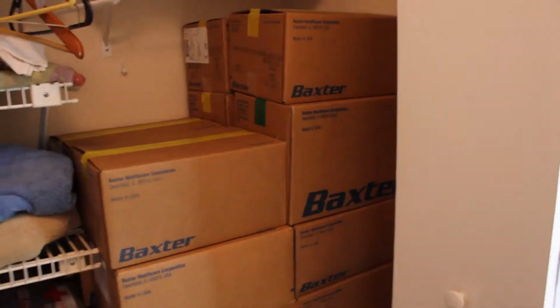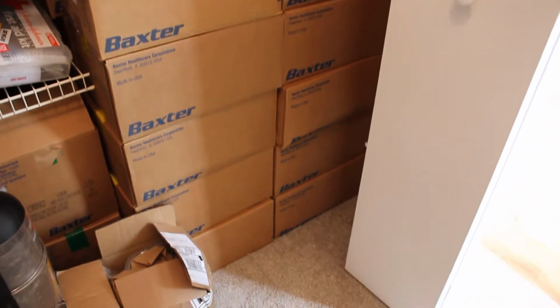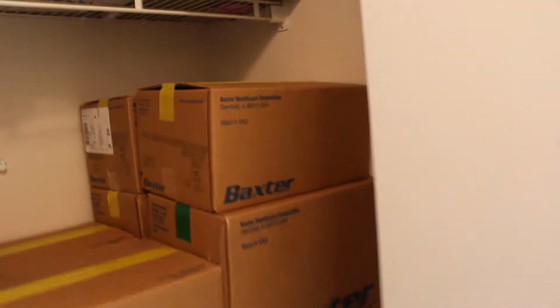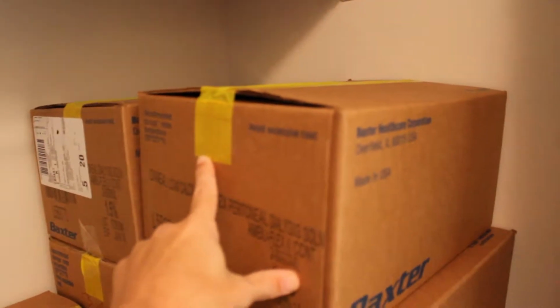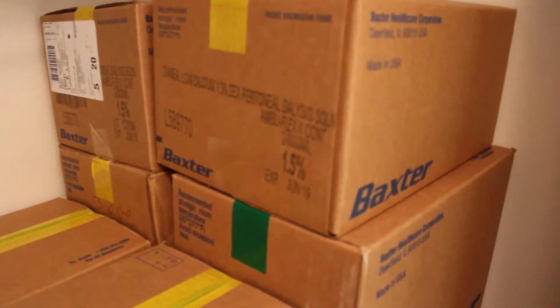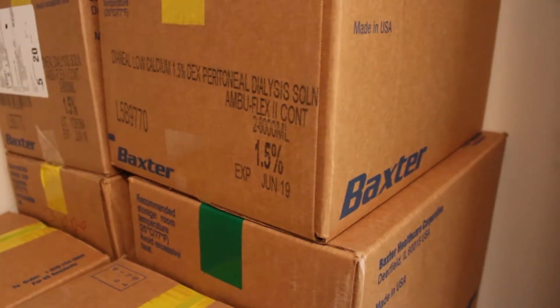I have some of them in this closet right here, and as you can see, there's quite a few of them in here, and they're all labeled Baxter because that's the company that delivers mine, so yours may have a different provider on them. And mostly what I use are these, and you can see by the color of the tape, this is a yellow 1.5%. Let me fix the focus real quick. There you go.